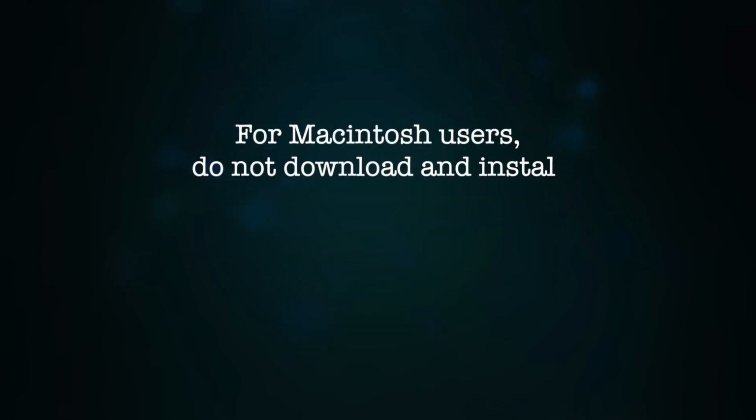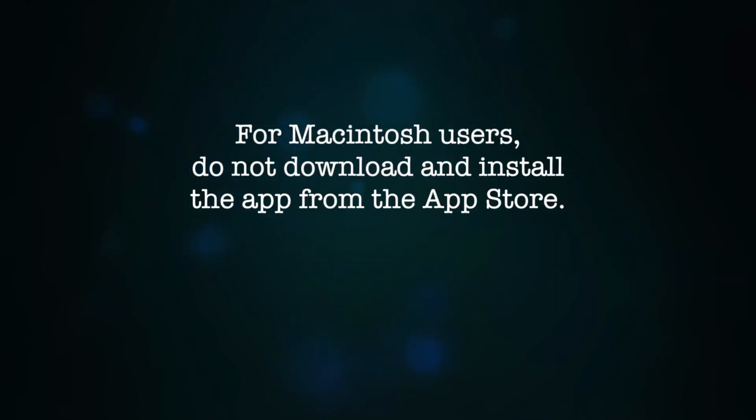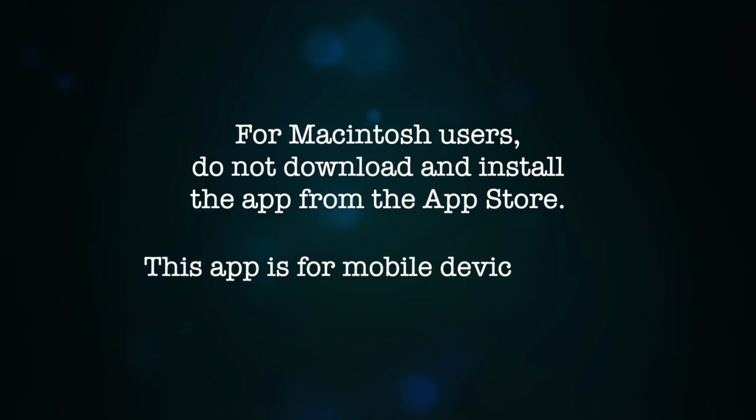For Macintosh users, do not download and install the app from the App Store. This app is for mobile devices only.